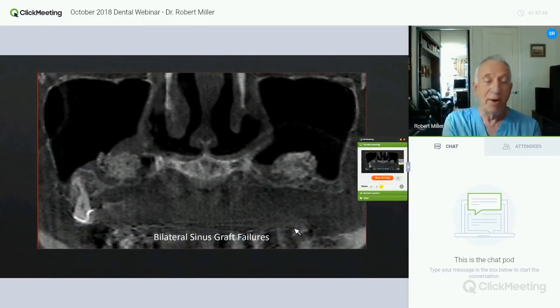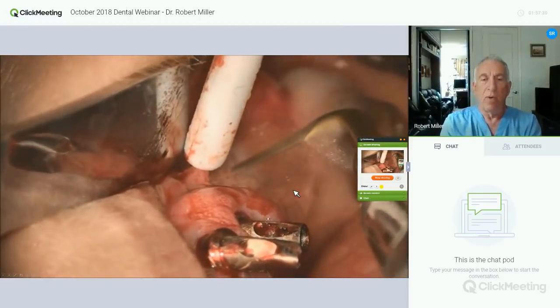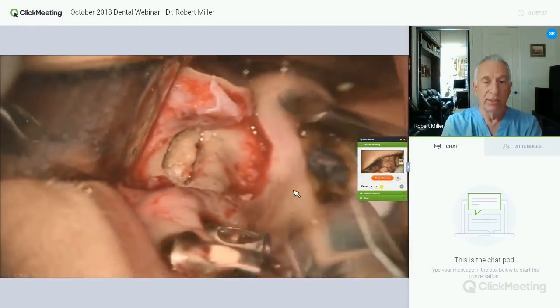Let me give you an example. I don't know if anyone has ever had the opportunity to re-enter a BioOss grafted sinus. Well, here's a case where I actually did revisions, bilateral sinus revisions, and you can see a lot of dense graft material that still remains after 2 years. So here is the upper left side. I went ahead and did a lateral wall window, your typical lateral wall approach. But it's not an open sinus, it's just going to be graft material inside.